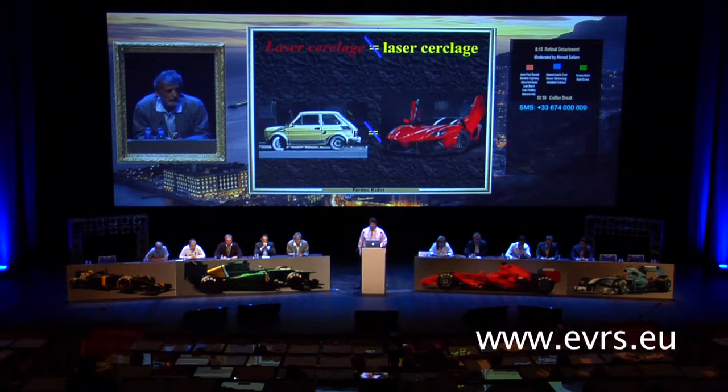And one final addition to what I said: every time I do a reoperation after a previous vitrectomy, I find residual vitreous. So one thing you can do to enhance the effect of what you are doing is laser cerclage. Now, if you look at the literature, you will find quite a few articles which say it is not effective because you will have a new break developing at the central edge of the laser cerclage. But laser cerclage and laser cerclage are not the same things.